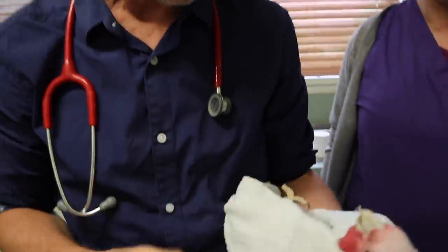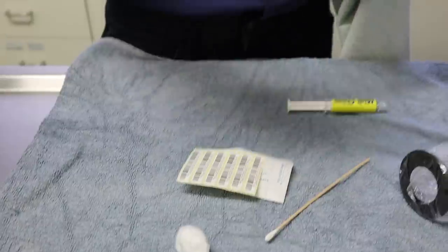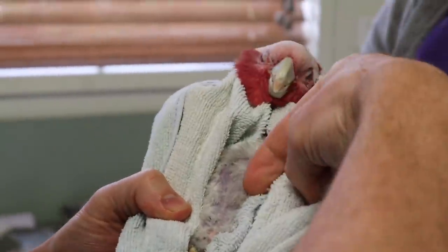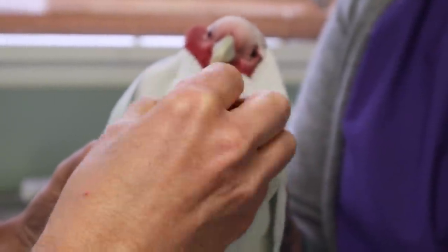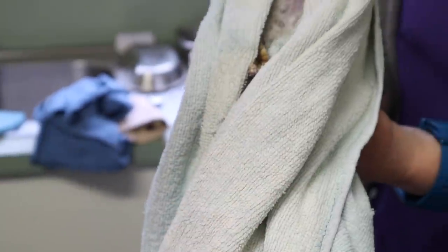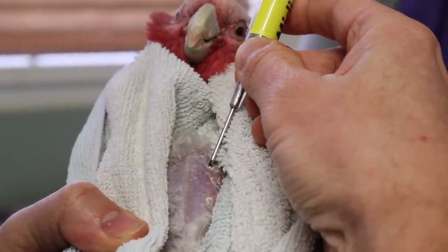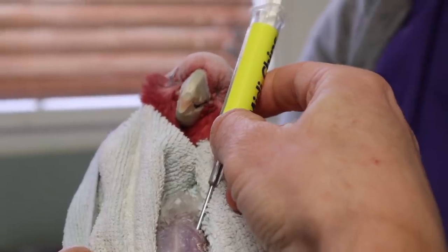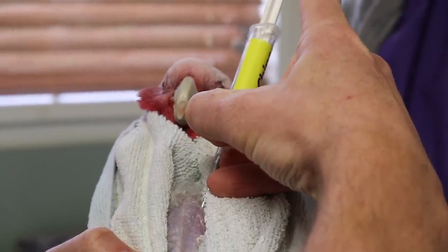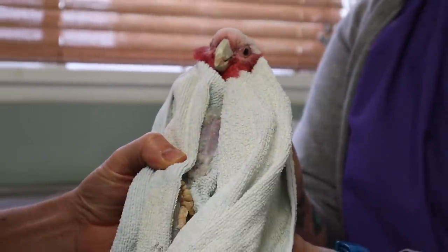When we microchip larger birds, the first step is to make sure the microchip works and the numbers all match, and then make sure the bird hasn't already been microchipped in the past. I prefer to go down into the muscle, get a little bit of alcohol just to clean the area — that helps keep the feathers away as well. The microchips are quite small and not irritant; the biggest issue really is just the size of the needle. With the bird restrained, I just gently put this on. These needles are fairly sharp, so I just put gentle pressure and gently push them into place, keeping them fairly shallow. Once it's in place, put the needle in — check the chip, the chip's working.